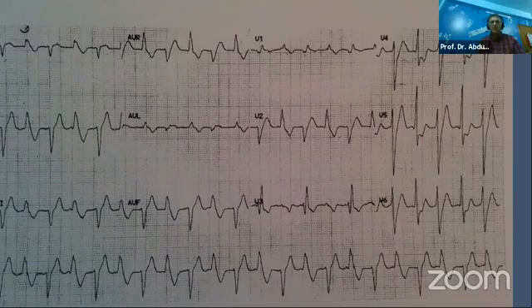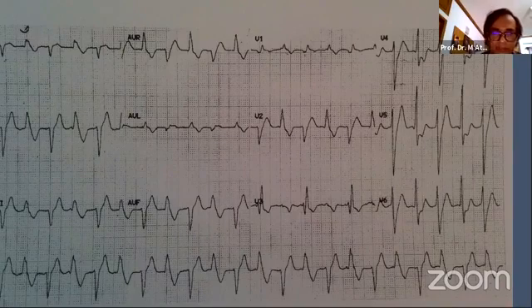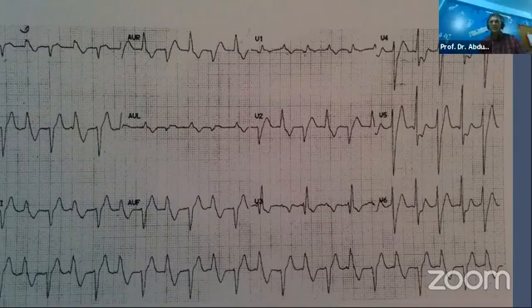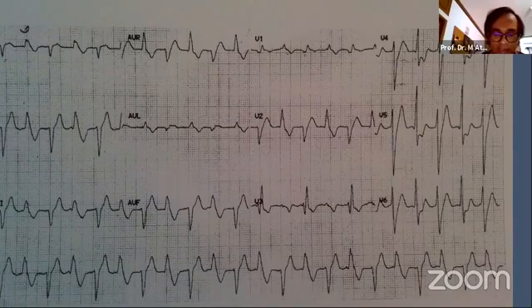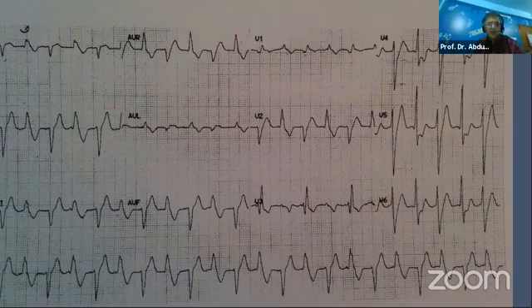এই সার্কামস্টেন্সিয়াল এভিডেন্স গুলো কিভাবে কাজে লাগাতে হয়, আমরা এই জিনিসটা আস্তে আস্তে কিন্তু ব্যাখ্যা করতে। এই যে আমি যেটা বললাম বা মনোয়ার যেটা বললো, আমরা কিন্তু কেউ কিন্তু ECG কিন্তু আতার ভাই আমাদেরকে দেখাই নাই, আমরা কিন্তু ইনস্ট্যান্টানিয়াস কমেন্ট করতেছি আমার কি মনে হচ্ছে। জামিল ভাই যেটা বলতেছেন, জি। VT আসতে পারে as a idioventricular rhythm, but in that case, all the complexes will be on the monomorphic. Right. Yes. This should not be the idea.